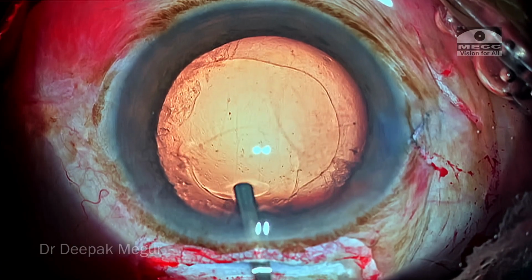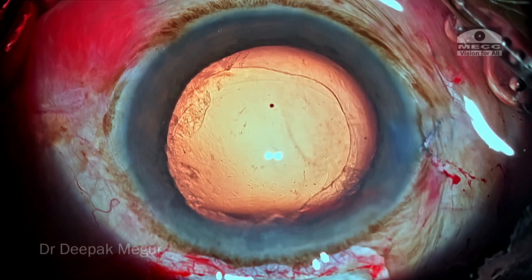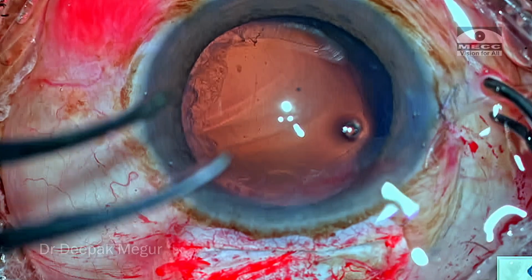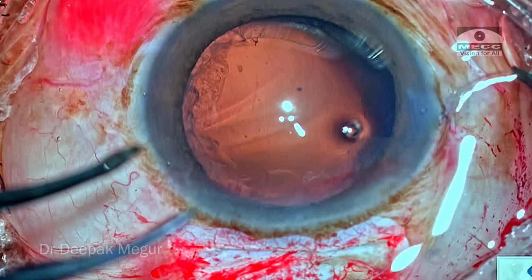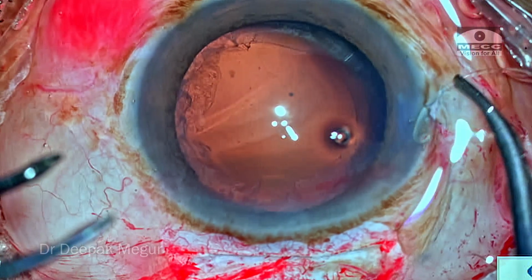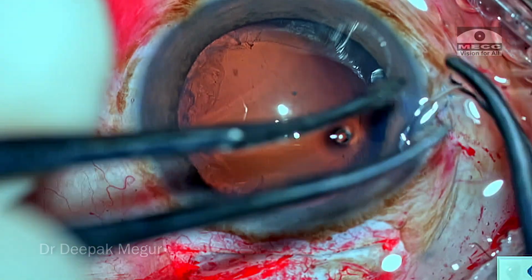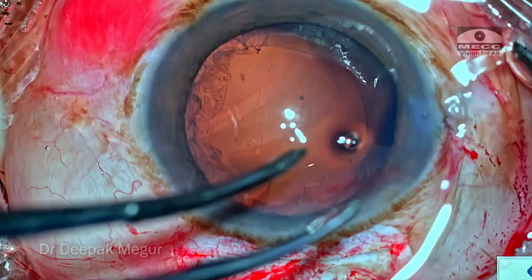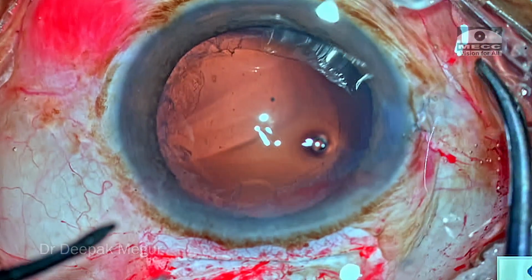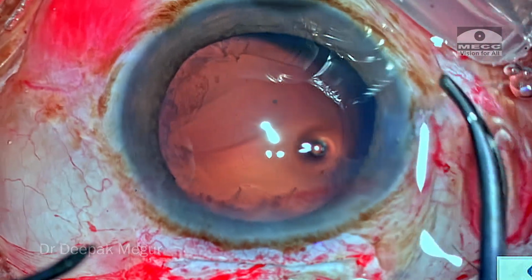The chamber is inflated well with the OVD, the posterior capsule is pushed back, and now he's got a CTR, which is a regular size CTR of 11 and 13 millimeter. And now he's beginning to introduce it. Now you can see that the CTR looks very springy in nature, and the surgeon is finding it difficult to judge the consistency, the way it behaves. It keeps on slipping. Let's wait through it patiently and just try to see how things turn out.